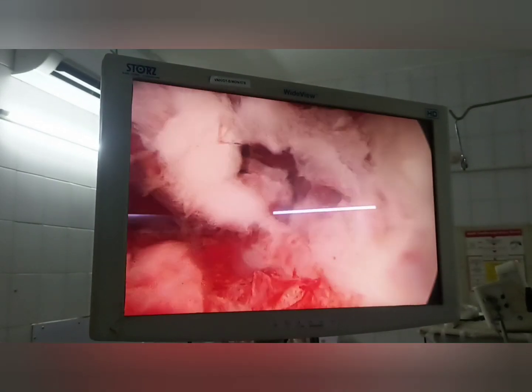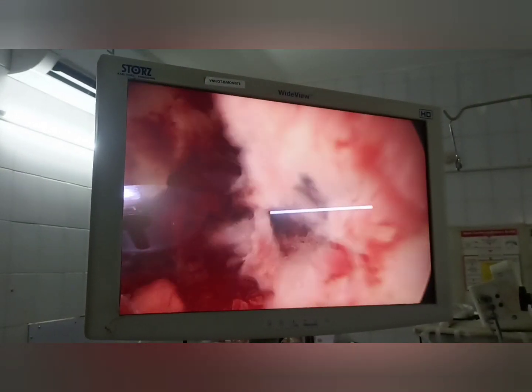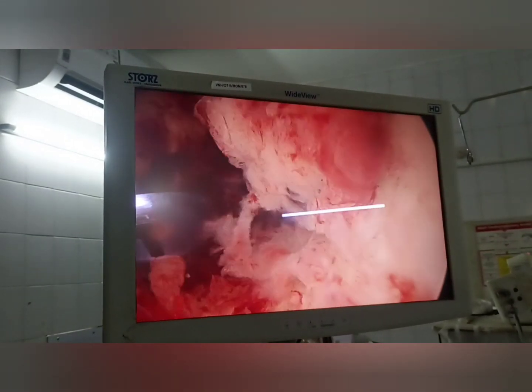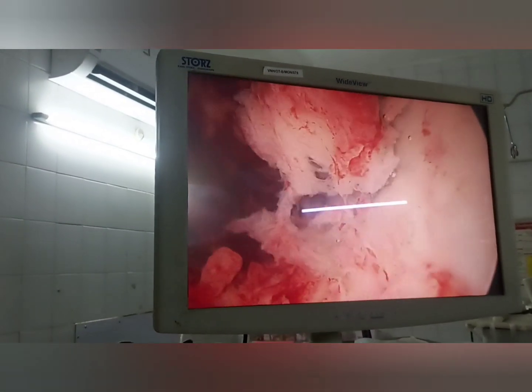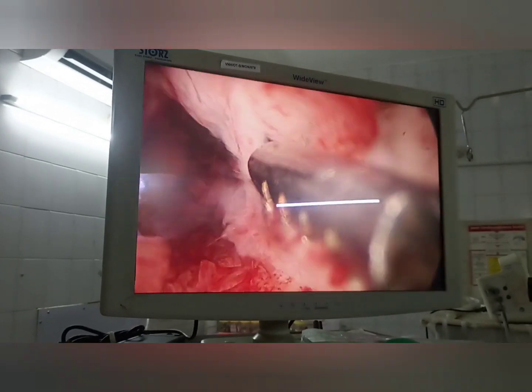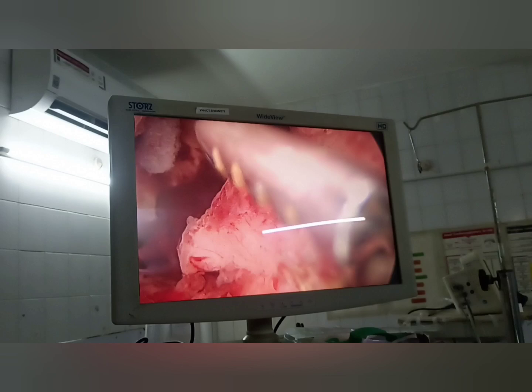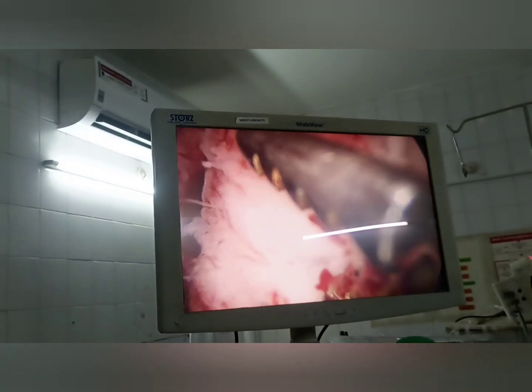The main advantage is that it avoids any kind of cervical erosion or cervical damage, which is important if a female is planning pregnancy. However, if she is multiparous, because of the patulous cervix, the whole polyp can be brought out in toto as well. So now you can see this grasper will grasp the polyp part.